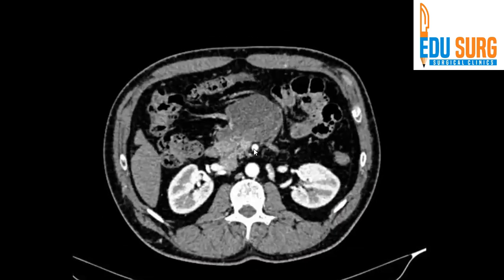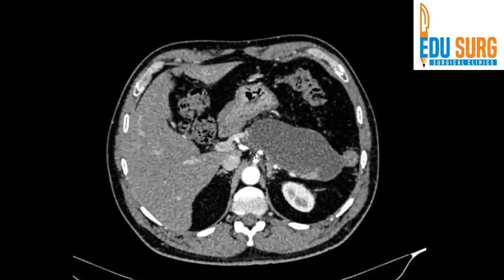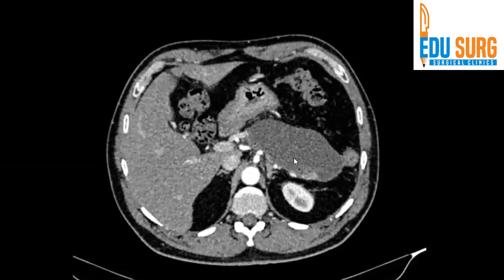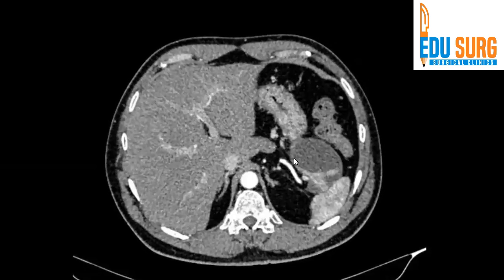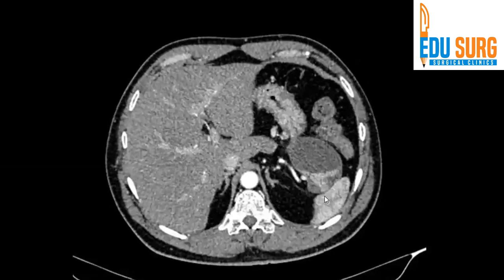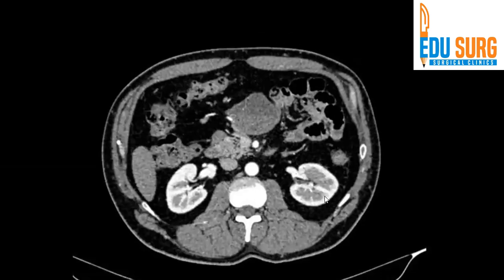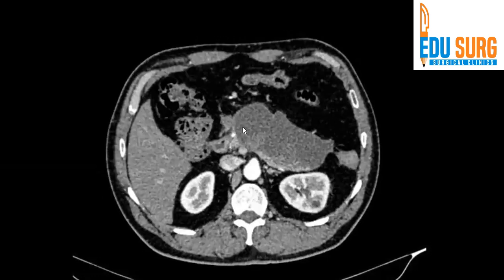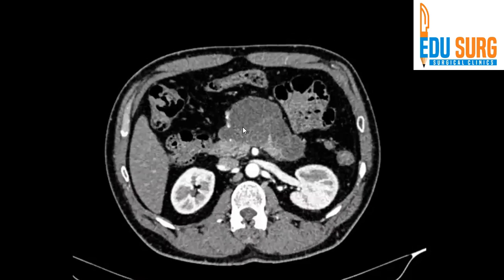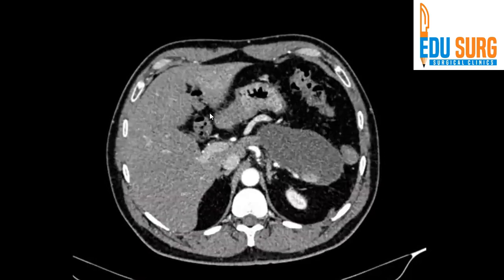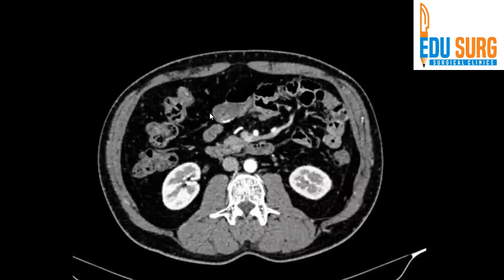Since this is the arterial phase, let us look at all the arteries. That is the SMA — the superior mesenteric artery — and the celiac artery. The splenic and the common hepatic arteries are visible. Let us trace the splenic artery behind the pancreas going into the spleen. The splenic artery looks okay — there is no aneurysm, which can be a frequent complication of pancreatitis. SMA looks good. Gastroduodenal artery also looks good. There are no pseudoaneurysms present in this case.